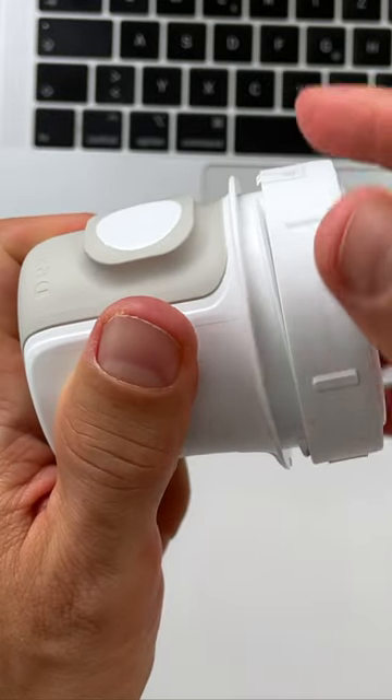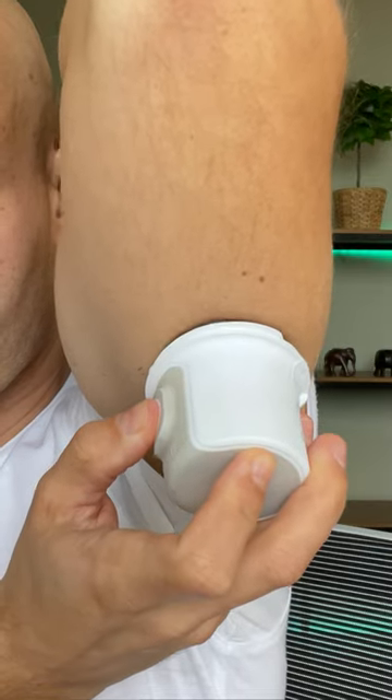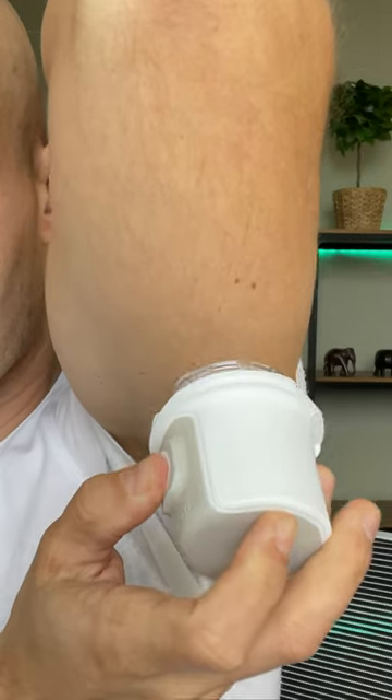I kind of like how Dexcom made the G7 applicator. Here you also unscrew the lid and place the applicator over the site, but then you just press this button and the sensor gets inserted kind of on its own.